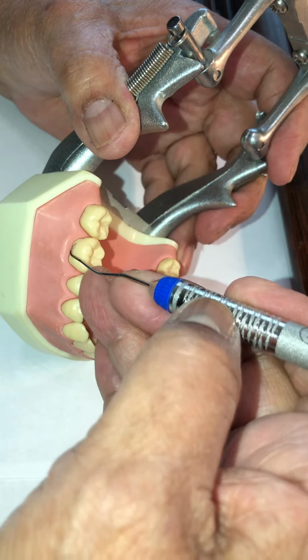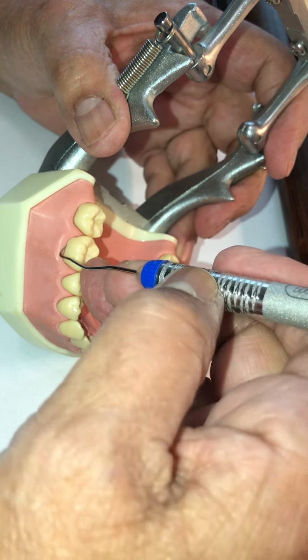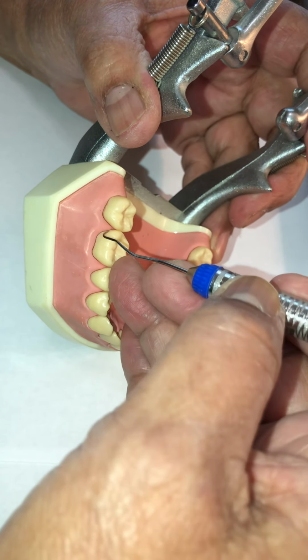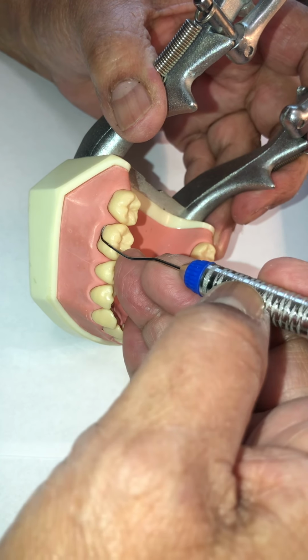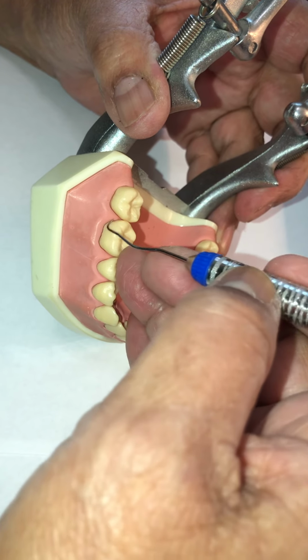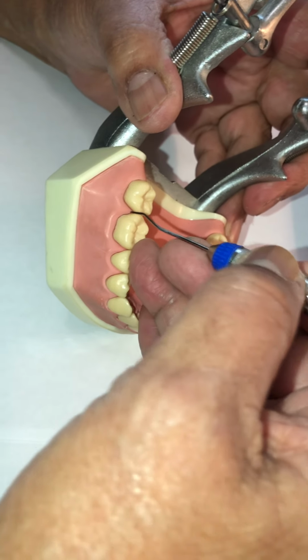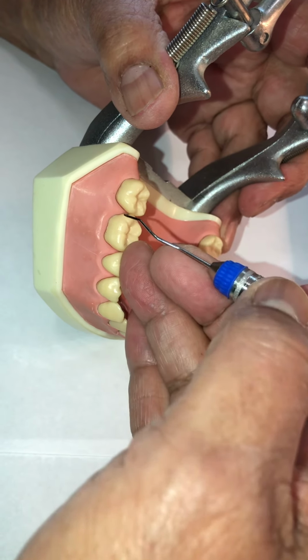We never back out. The point is the headlights. Pretend they're the headlights of a car. So the only way you can go, if you're driving this car with these headlights, is in this direction. You never back your car up like this, okay? Especially if you're going on a rounded road, and this is our rounded road here. I'm just trying to give you an analogy. You're never going to back it up. You always follow the direction that you're going. I'm going distal, and that's where I'm going. It's as far as I can go. I'm going to pull out.